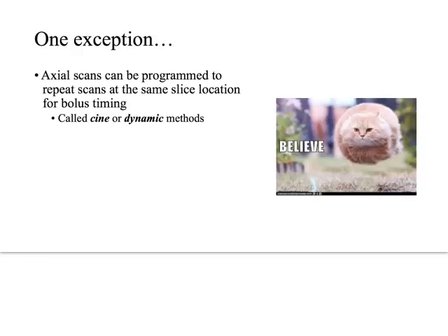There is one exception though, right? There's always an exception to the rule, and there is a time when axial scanning could be useful, and I would say that's during any kind of interventional procedure. So if we're doing an interventional procedure where, for example, we need to place a needle inside of an abscess and drain the abscess, it could be helpful to do single axial images, or a series of axial images, but a single axial image at the level where we're trying to place that needle, because we'll be able to help guide the needle in, right?